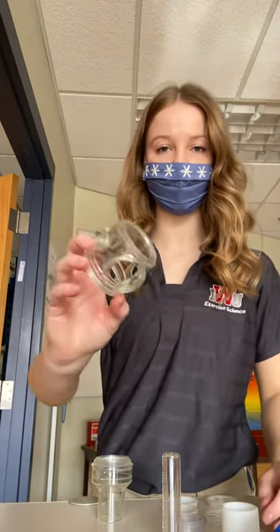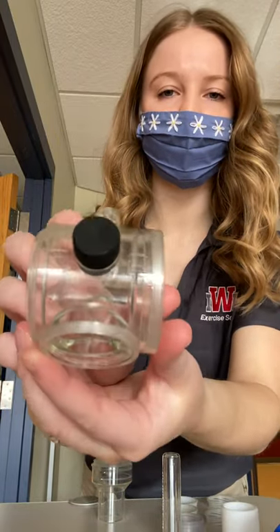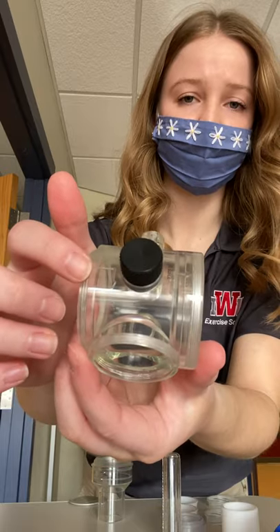All right, now for the actual assembly of the mask. You're going to start with your center valve and you will want to look for the arrows on the top — you'll need that for later. Just pay attention to where the arrows are; it should be the same side where this little black knob is.